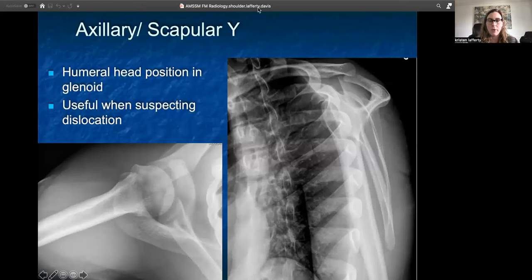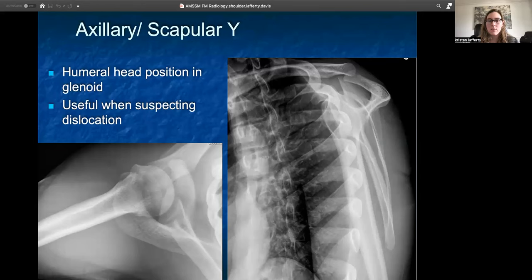Axillary and scapular Y views — the axillary view and the scapular Y view — are most useful when suspecting a dislocation. They look at the relationship between the glenoid and your humerus to make sure there is congruence, that they're meeting one another. If they're not, that's when you suspect a dislocation.